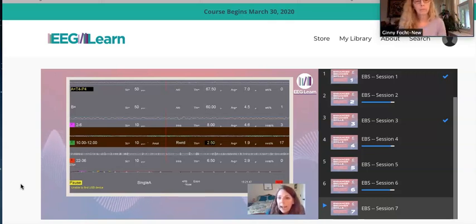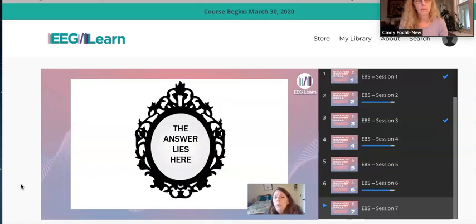If we're rewarding in the alpha range, that's more of this nice open focus. If it's the low beta range, that's a calm external focus. If we're working on the left side and we're doing activating, that's going to be a mid beta, a more engaged focus. So if we see the slow wave going up, chances are they might be losing their focus a little bit, either because they're getting sleepy or daydreamy, or they're just replaying something in their head. They're not really here right now with what they're doing.